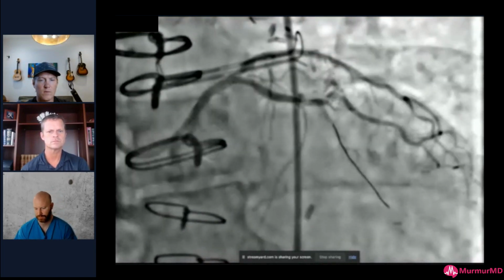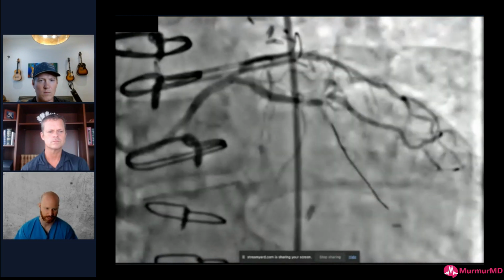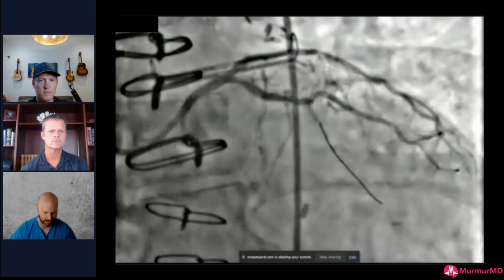Of course, the way the emitter works is it creates a field that is roughly equal across the entire balloon length between the two emitters. But that being said, there's still a little bit of a peak effect at each emitter. And so I try to march them through with the idea that we're getting the highest level of focused energy, in little peaks all along the nodule of calcium if I can.